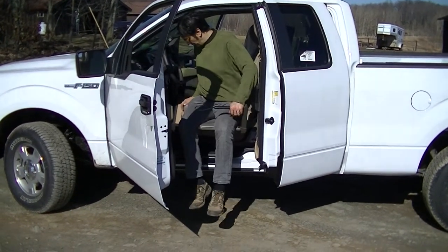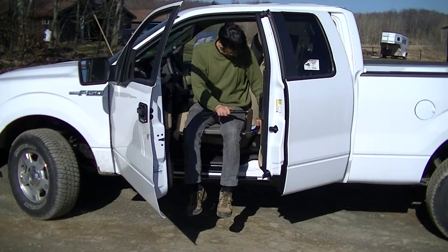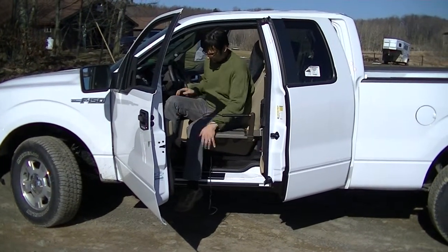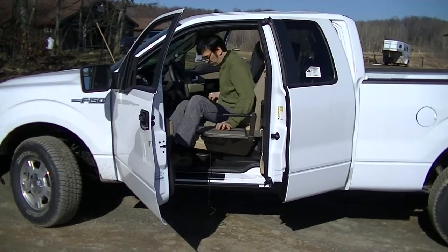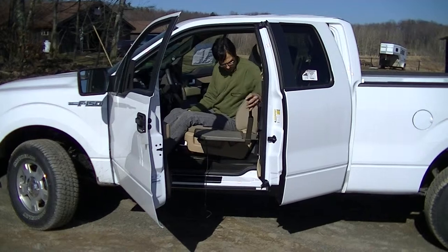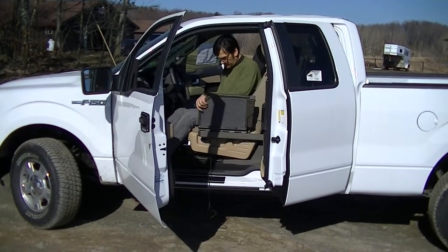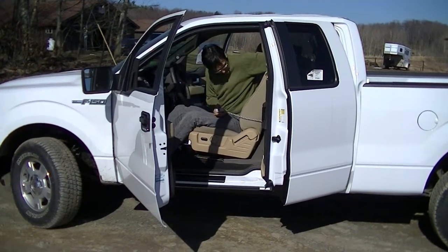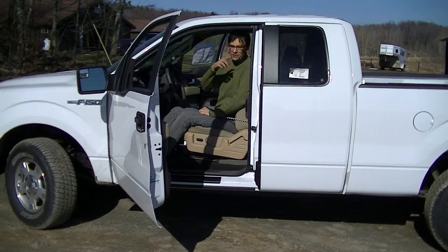Our next step is to transfer in. We can adjust our height a little bit so that we don't have to go uphill — hopefully a little bit downhill. Move the cushion in, stow the handle, put the seat up, raise the seat all the way back and around, close the door, and we're ready to go. Thank you very much for watching our video.